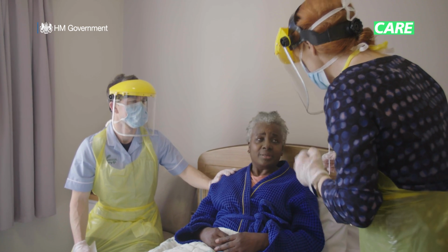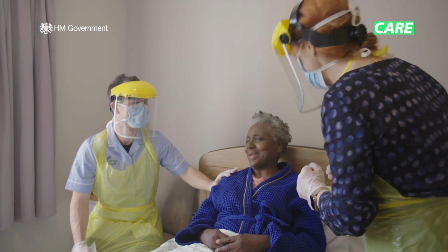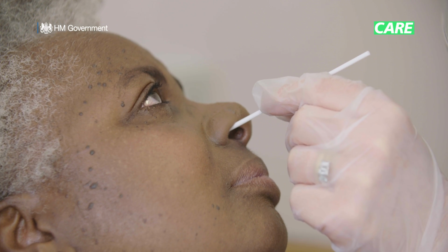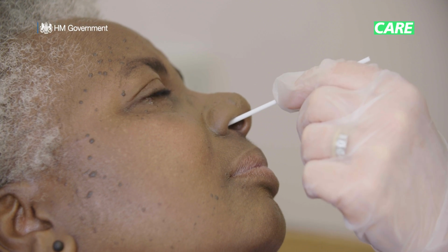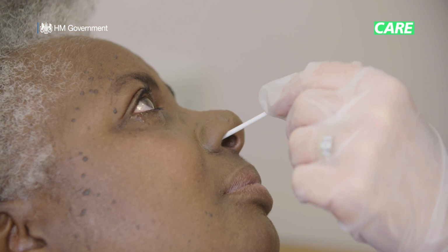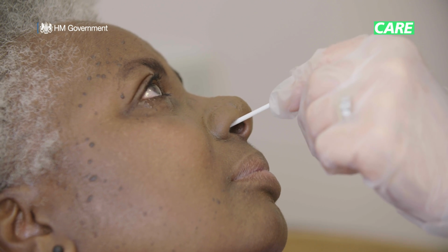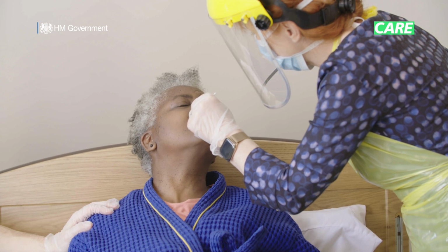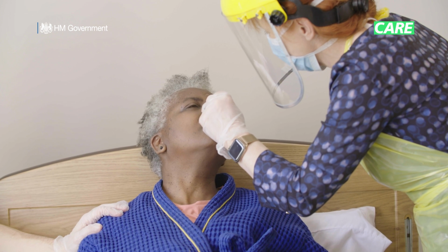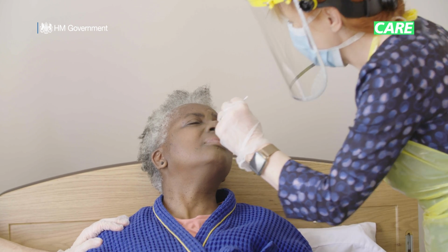Next, you're going to swab the nostril. Again, checking that you have their consent. Gently place the same end of the same swab, about 1 inch, that's 2.5 centimetres, into the nostril. Don't insert the swab any deeper if you feel strong resistance or if the person alerts you to pain. Again, do explain in advance that it may cause them a little discomfort, but it shouldn't be painful. Rotate the swab for 10 to 15 seconds and then slowly remove it.